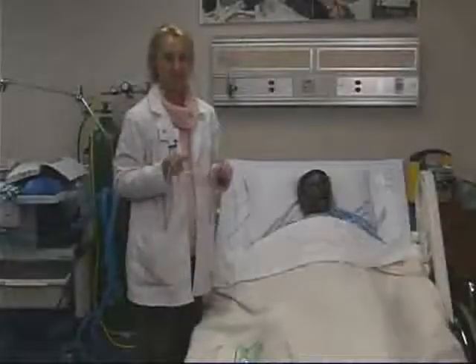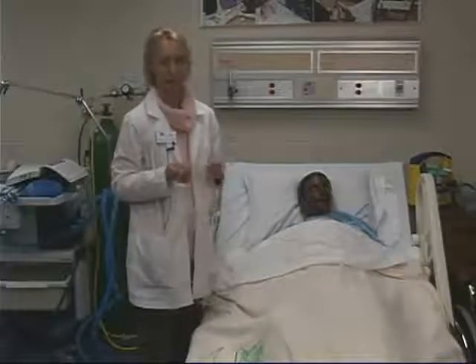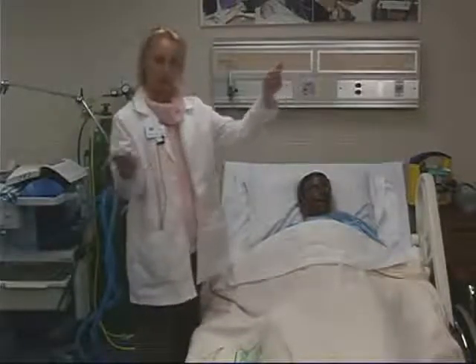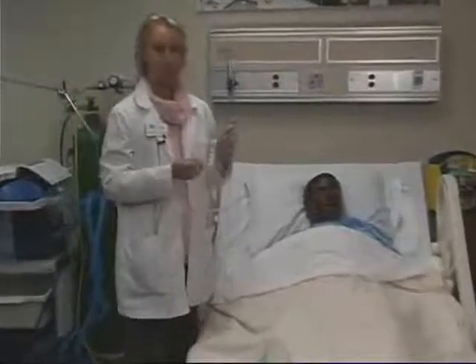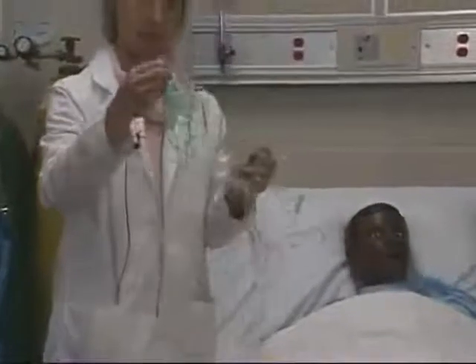Hi, my name is Jackie Resick and I'm going to show you today the use of a nasal cannula for oxygen delivery to the patient. This is a nasal cannula and one of the reasons we use this is that it's simpler for the patient. It's more comfortable than a simple face mask. I'll talk about simple face mask in a little bit — I just wanted to show you the difference.